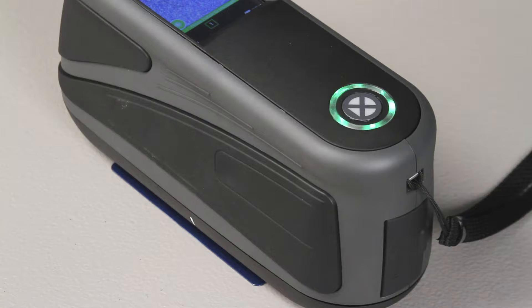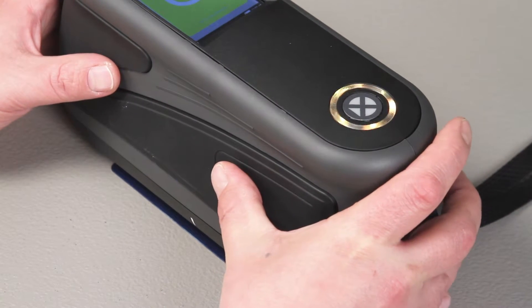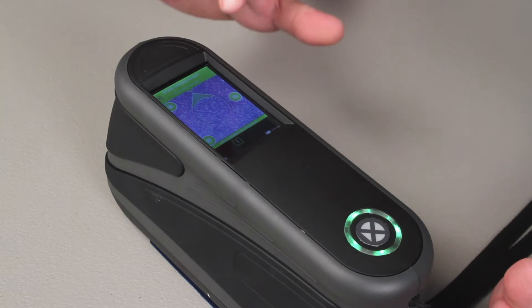There are three ways a measurement can be triggered. You can push either of the side buttons, you can push the power button on the top of the device, or you can simply tap the center of the touch screen.